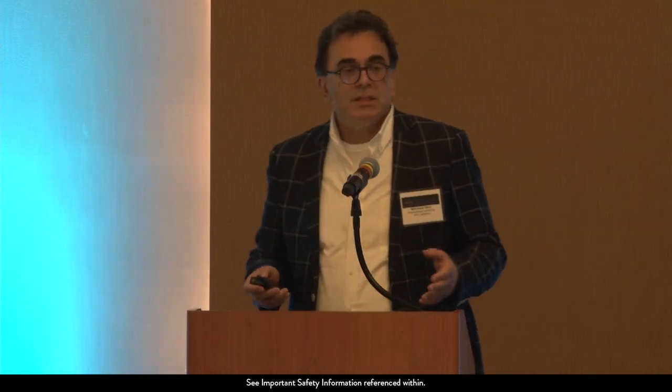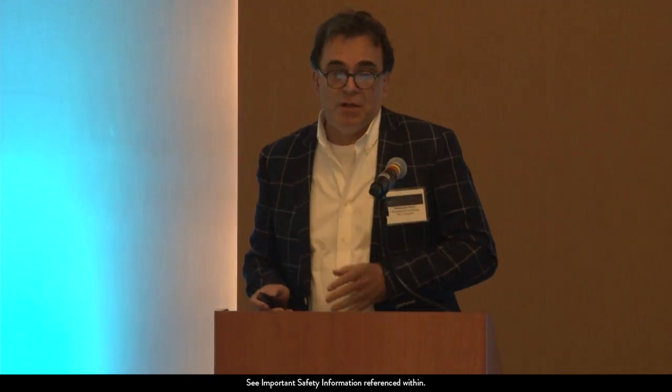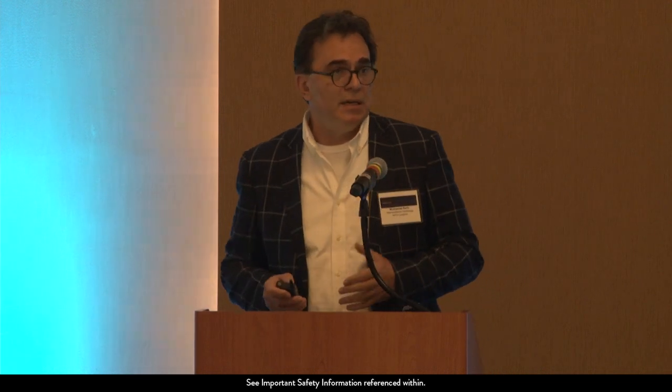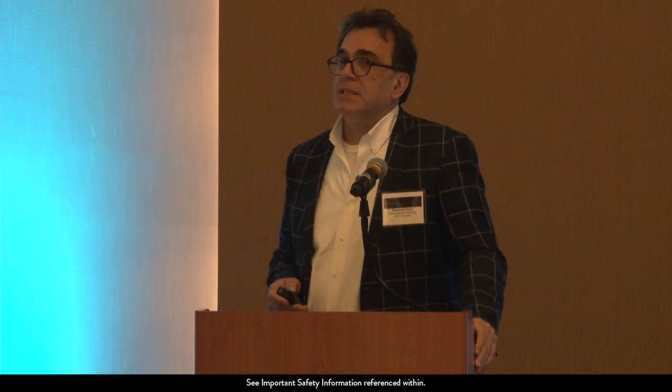We're going to talk about the post-procedure, but we play a role in pre-procedure, intra-procedural, and post-procedural imaging. As we have already discussed, current practice is typically TE-driven, meaning that transesophageal echocardiography pre, intra, and post-procedurally is probably the primary imaging modality nationwide, with some part of CT imaging.